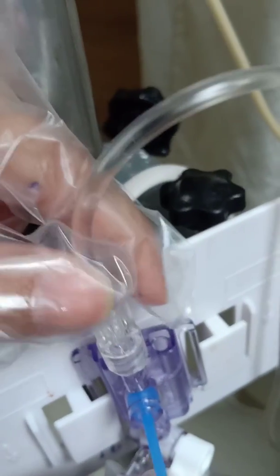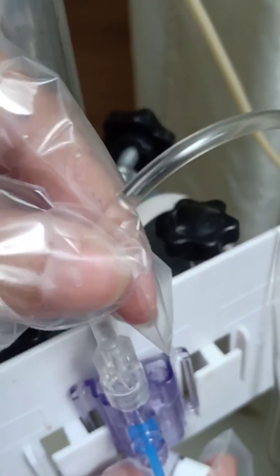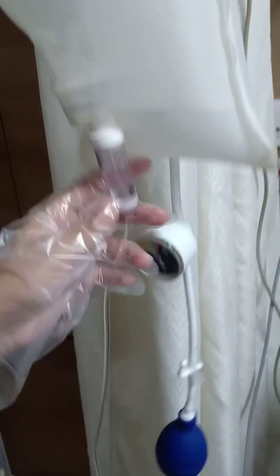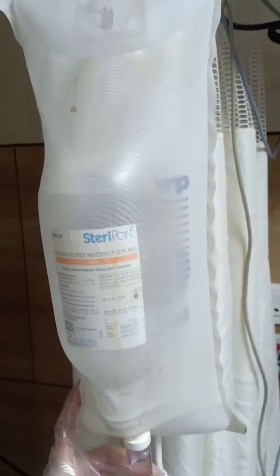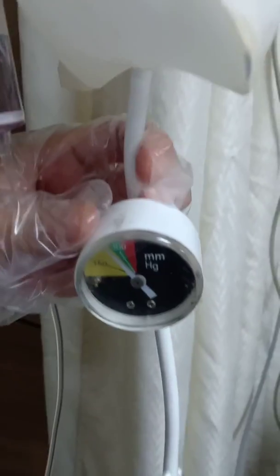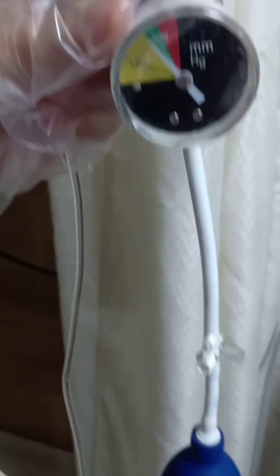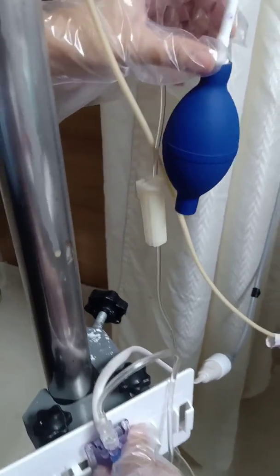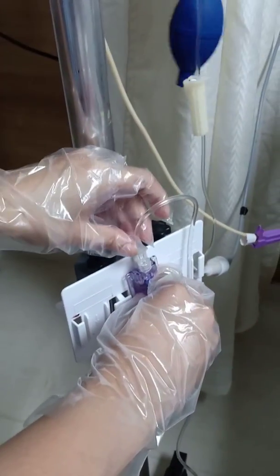From the transducer we can see two lines coming out. One is a white wire which connects to the monitor, and the other goes to a pressure bag. The pressure bag is needed because the arterial system is very high pressure — if we do not counter it with pressure from another side there could be back flow. This bag is inflated, and the inflation pressure is generally kept at 300 mmHg. This ensures that back flow would not occur, and also causes a continuous flush of fluid through the system.